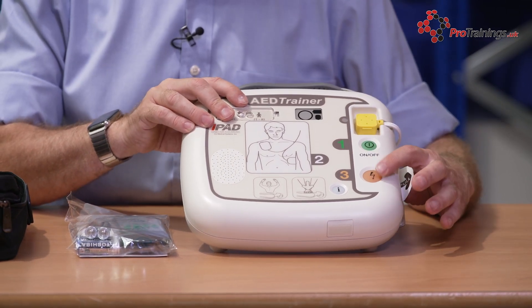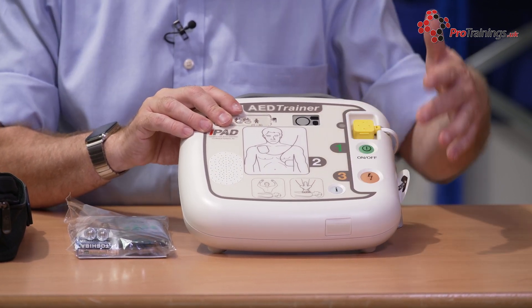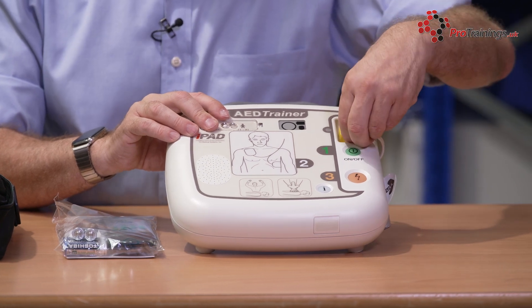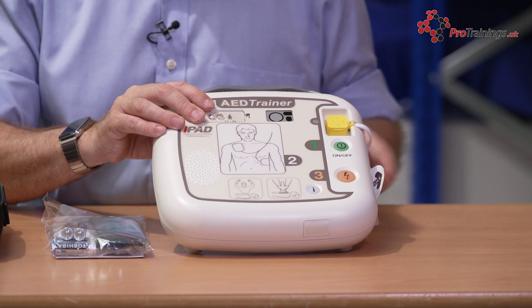This is a semi-automatic AED, so there's a shock button on there. The I button can do other changes — change language and things like that. You have a plug on the top here that you can remove and put back in so students can practice changing the pads.